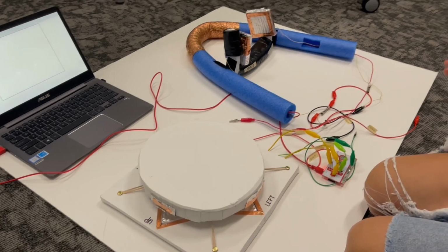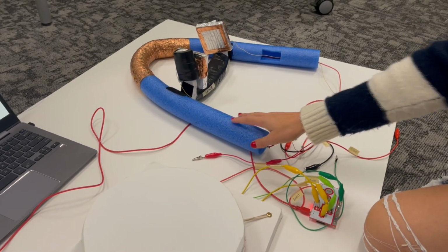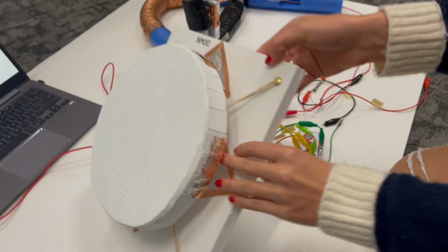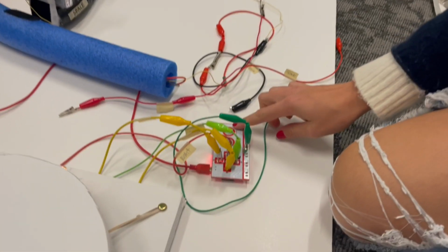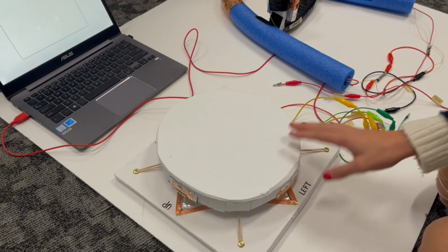So this is my Quadriplegia add-on. You have the foot attachment here and the neck attachment here. You're gonna first start by connecting the wires from the back of here onto the makey, and they're labeled, so it makes it super easy. And you can also use the neck attachment at the same time, connecting it to the space and click. But for the purpose of this video, we're just gonna be using the foot attachment to start.